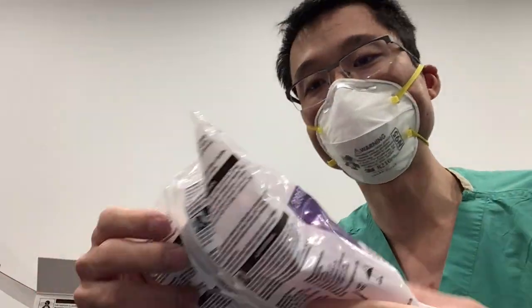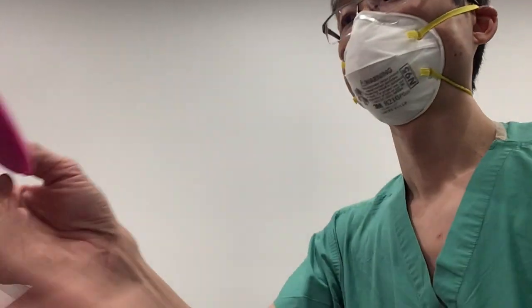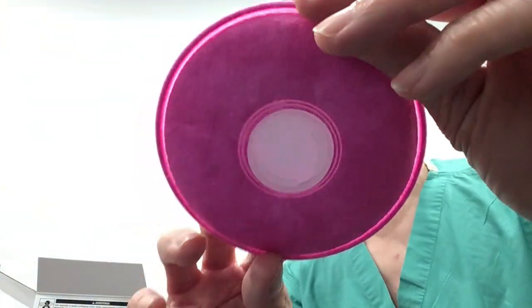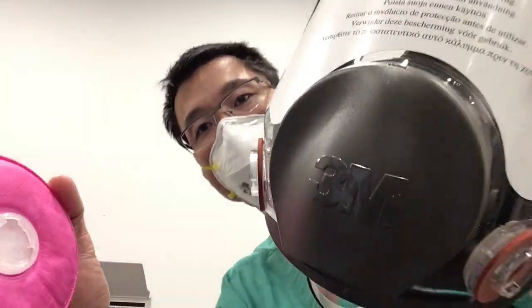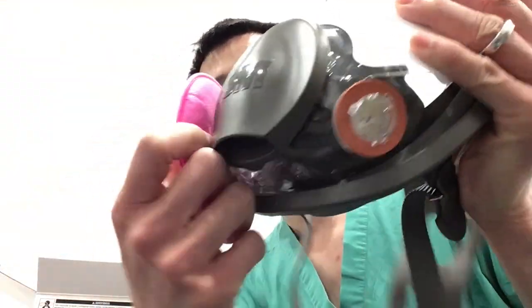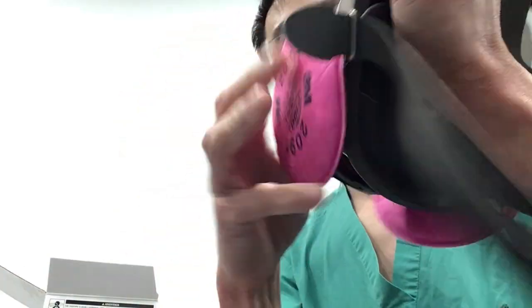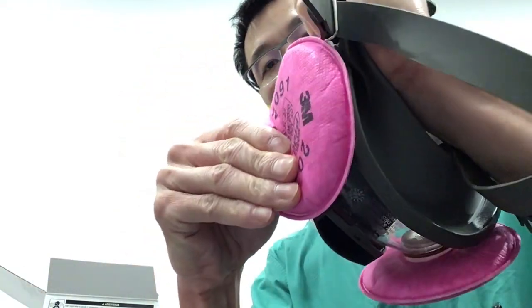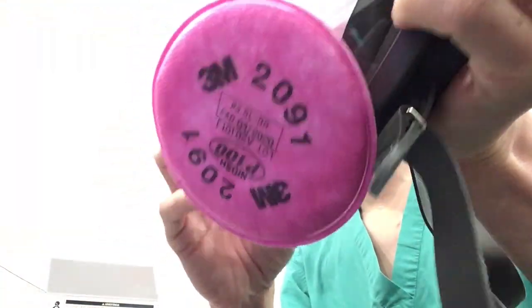Next we have the 3M P100 filters. We're going to open them up and take them out of the packaging. They're round and they have a special proprietary connector from 3M — they basically do a quarter-turn lock onto the 3M mask. We did that with both filters. This is pretty easy, and here's the full mask. We're ready for testing on our particle counter now.